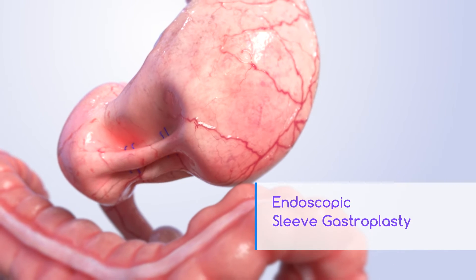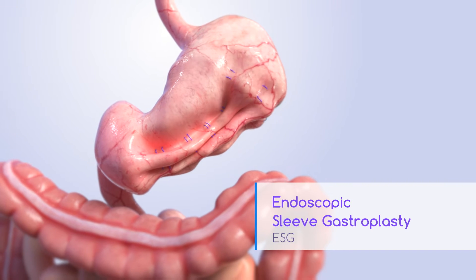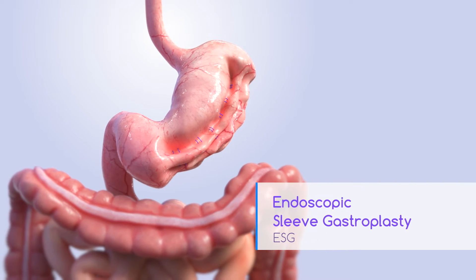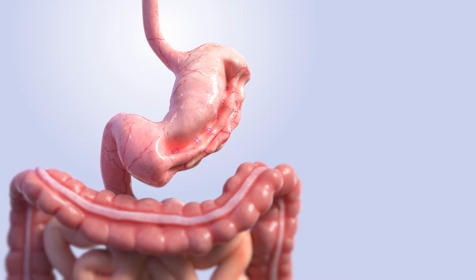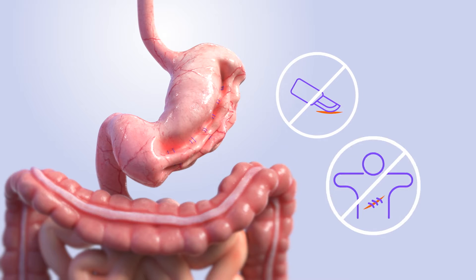Endoscopic Sleeve Gastroplasty or ESG is a weight loss procedure that reduces the size of your stomach so you eat less and feel full faster. It is performed by a specially trained doctor endoscopically, which means no incisions, no scars.